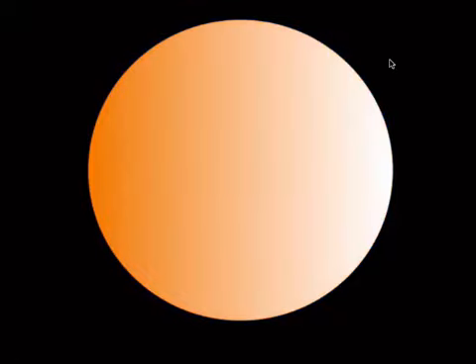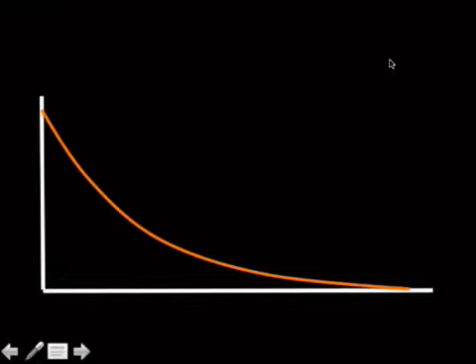That's not actually what happens. In reality, it's inhomogeneous. So there's this thing called T2, which you've probably heard of, but there's also a thing called T2 star, which is like T2 plus all the inhomogeneities in the magnetic field, the ones from intrinsic defects in the magnet itself, or susceptibility-induced field distortions from tissue or materials within the field.